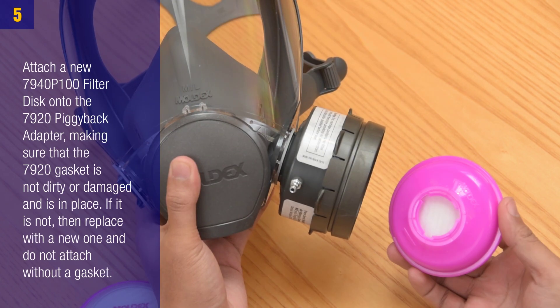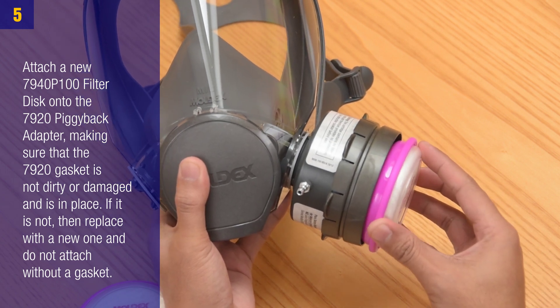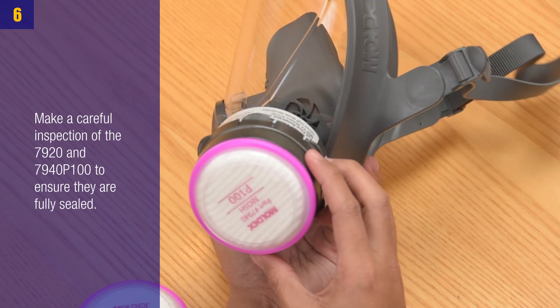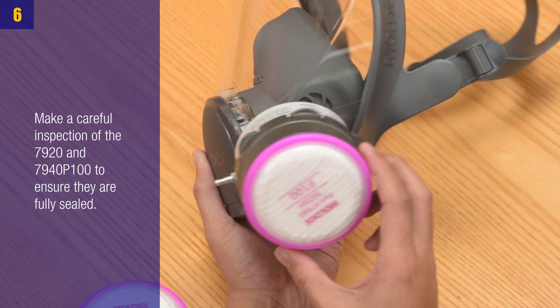Step 4: Attach the 7920 piggyback adapter onto the 7006 probed cartridge. Step 5: Attach a new 7940 P100 filter disc onto the 7920 piggyback adapter, making sure that the 7920 gasket is not dirty or damaged and is in place. If it is not, replace with a new one — do not attach without a gasket.